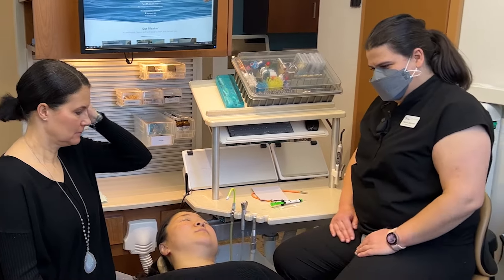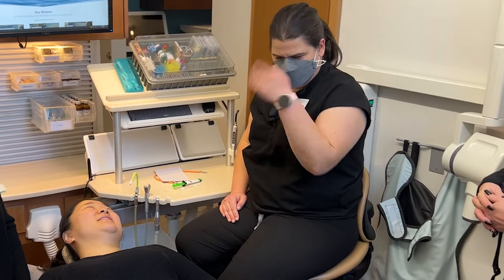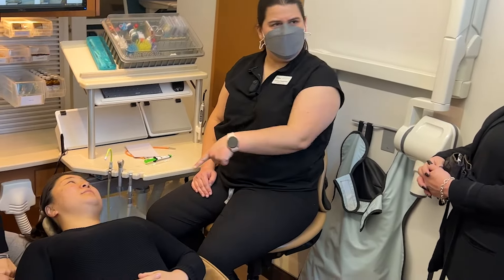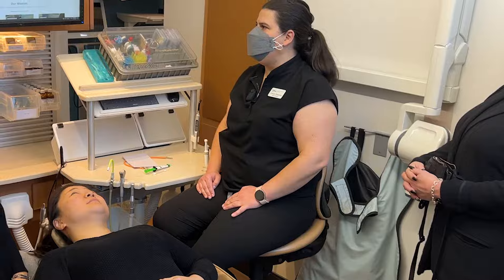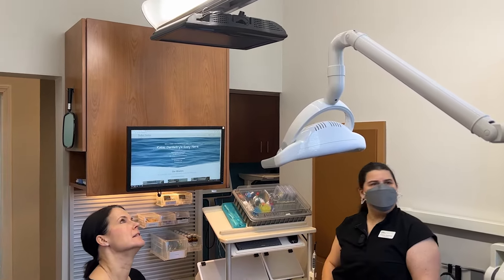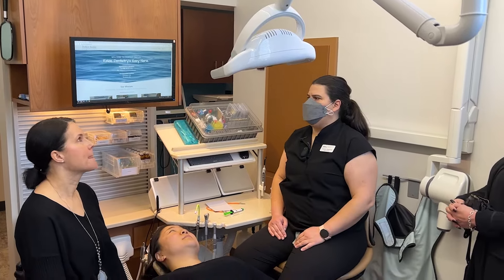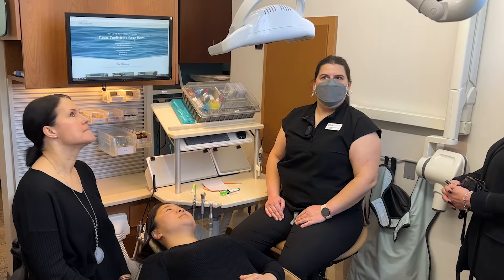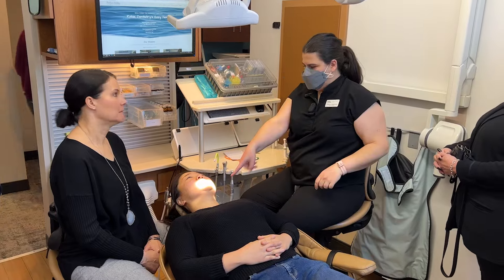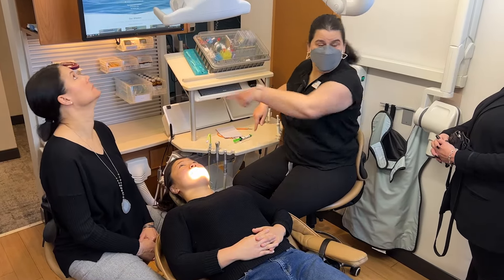How comfortable is that chair? Very. I didn't even give you heat or massage because we're at 50 degrees outside, so it doesn't make sense, but there is a massage feature. So what does she have to stare at now? Remember Dr. Avern's conversation about the lighting? She gets to stare at a nice TV. We have the ability to dim with these lights. You have your migraine patient that comes in and I need to be able to do dentistry. Light for me, because you probably wear loops.